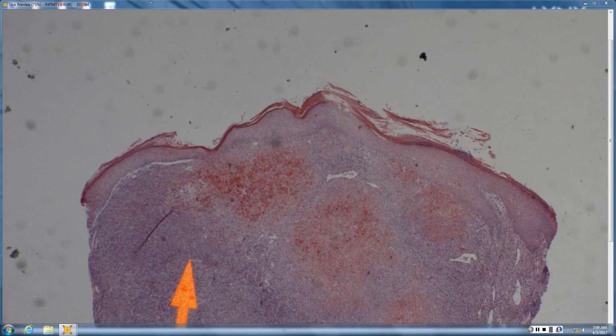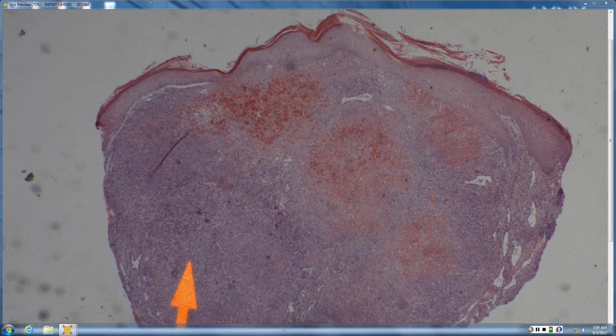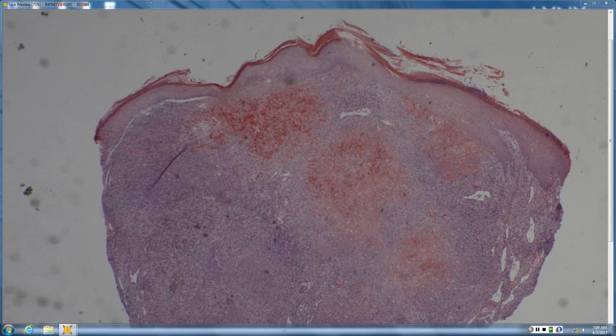Okay. Well, this is number 10, and it's bacillary angiomatosis. From scan, it's just sort of this dense dermal collection of either a proliferation or inflammatory cells. It's kind of hard to say. At the periphery, you can see that there are some vascular spaces, and so you might be thinking, well, maybe this is some sort of true vascular proliferation. Maybe it's even ALHE because there are so many inflammatory cells here. But this is almost like necrosis, and you shouldn't really be getting that with ALHE. And we need to get down and see what kind of inflammatory cells there are.